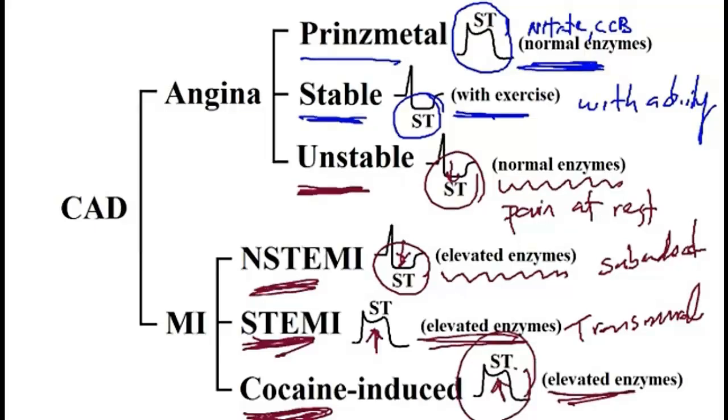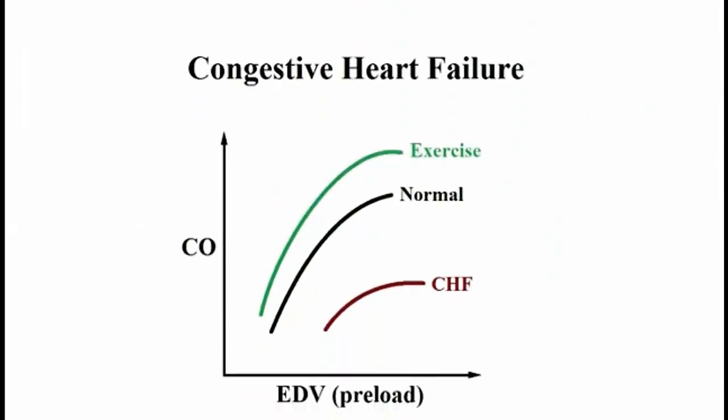Alright, now that we are done with the coronary artery diseases, I would like to discuss the congestive heart failure next.